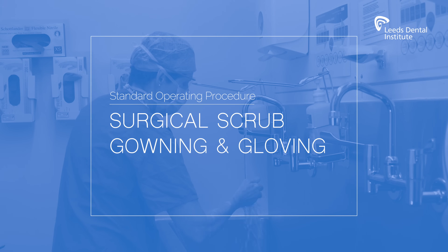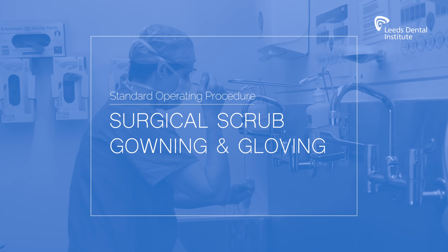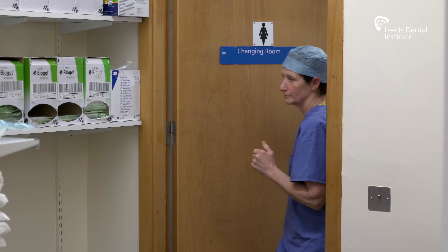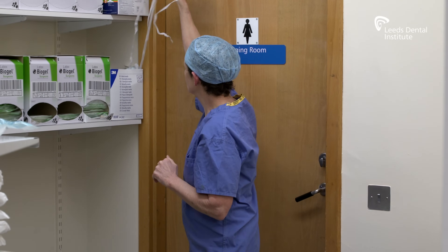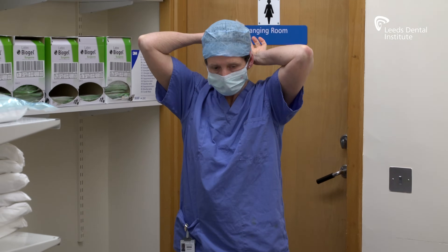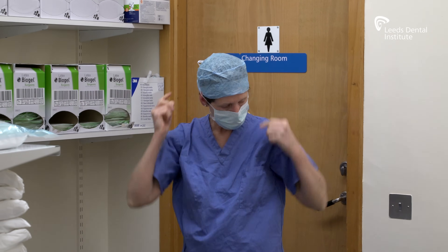This is a video summary of the standard operating procedure for surgical scrub, gowning and gloving in the Dental Institute. When undertaking any procedures within an operating theatre environment, appropriate theatre blues must be worn along with appropriate theatre clogs. Face masks and eye protection are important. The face mask should cover the nose and mouth.